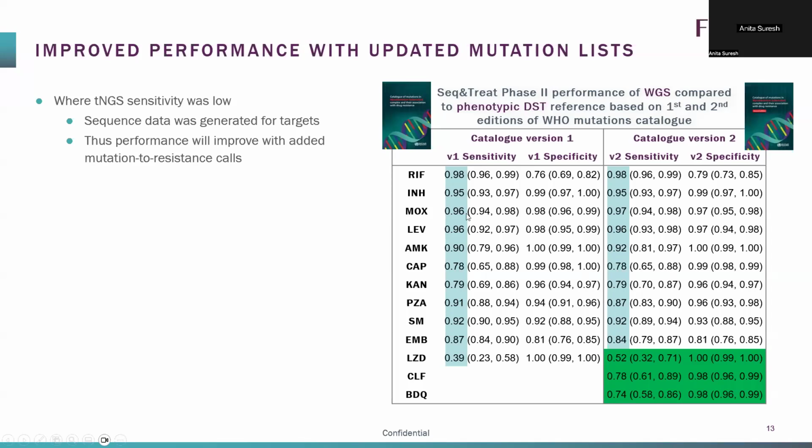These are obviously matching, they were high enough already. But you see for these drugs, we had nothing. We didn't even have any data corresponding to resistance in these drugs in the first version, because that was obviously 2021. So the data was any data that came before 2021, which means these drugs weren't really even being utilized in treatments. But after that, even WHO did a very specific call for resistance data on these drugs from the field, from any clinical cohorts and so on.